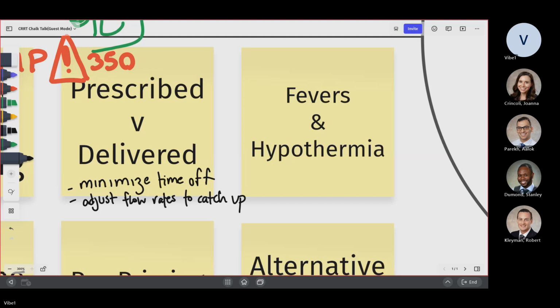But I think we have both double and triple ports here. Speaking of, real quick, in terms of access, it varies by a lot of people, but I actually might end up changing my practice. When you're talking about where you're placing and the length you're using, if you're doing groin, you should always use a 24 centimeter.